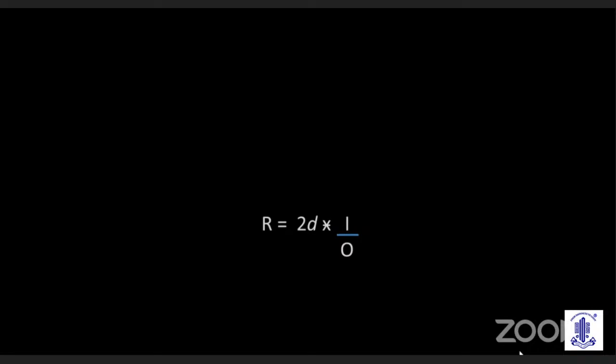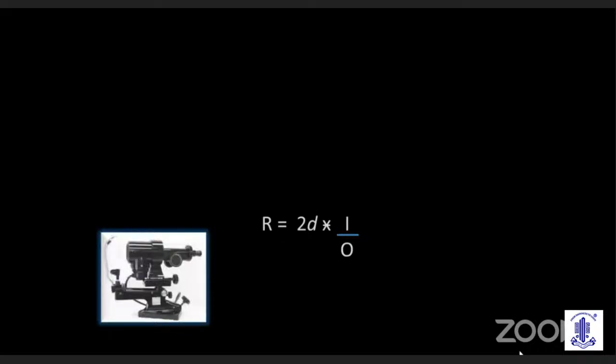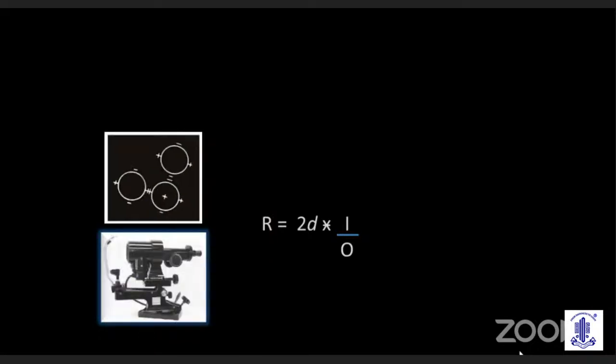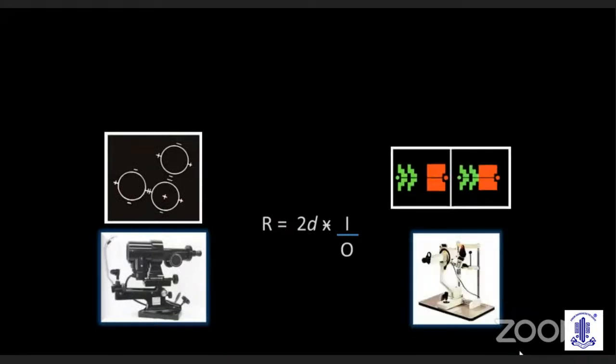When you have three variables that could be measured, or are constant, we can calculate the fourth one. Bausch and Lomb keratometers have a fixed object size, so if we measure the image size, we can calculate the radius of curvature. The Javal-Schiotz has a fixed image size, so when we measure the object size, we get the radius of curvature.